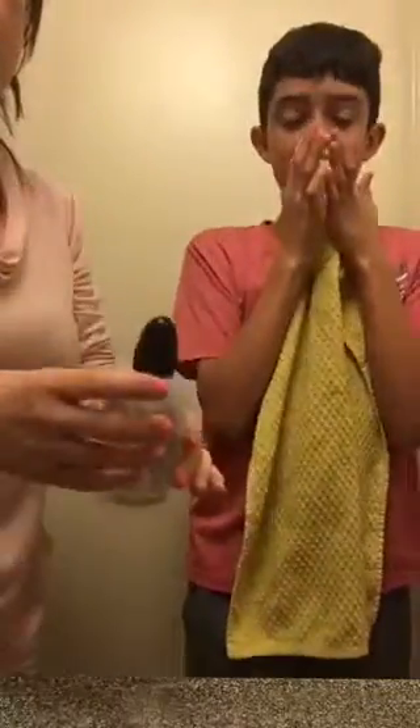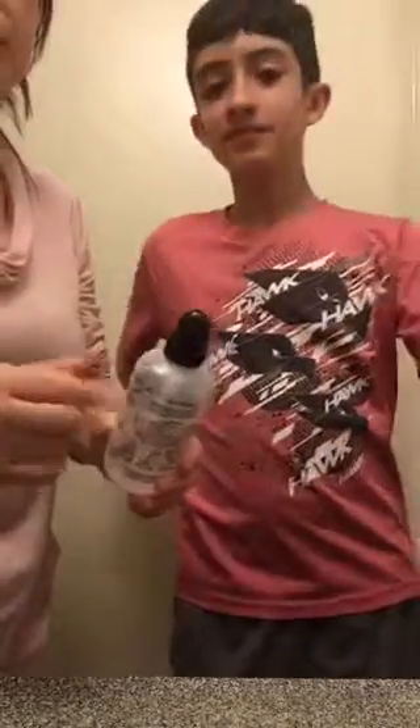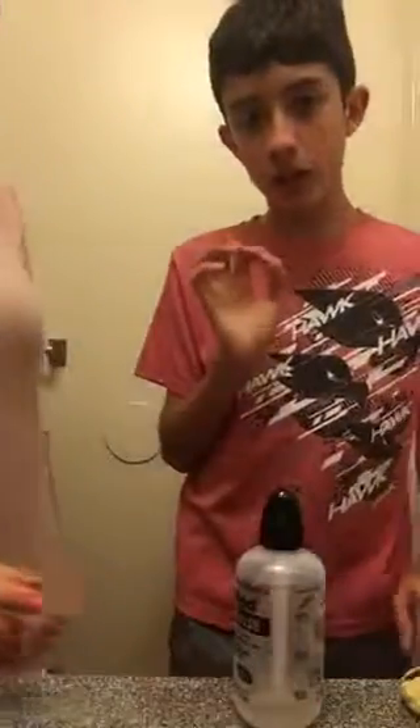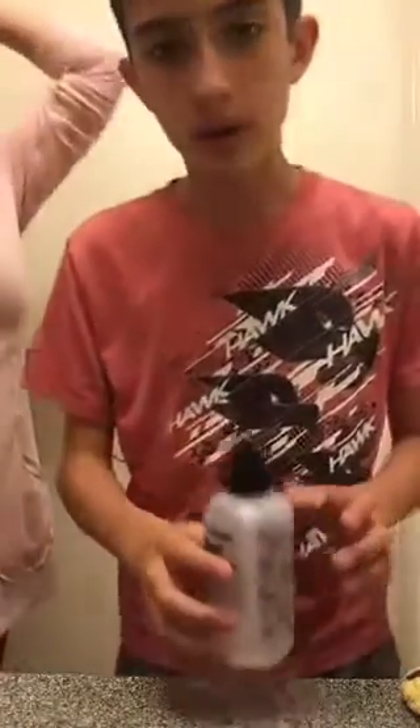Just use it until it dissolves and use the rest. The reason you want to use this is because as an allergy sufferer his nose will get irritated throughout the mornings and at night. Whatever allergens affected him in the morning will probably still be in his nose at night, so before bedtime flush or rinse. This seems like it's working! It's faster than the Neti Pot — the NeilMed sinus rinse — but the Neti Pot is a blue little teapot and it takes longer and you have to tilt your head more.